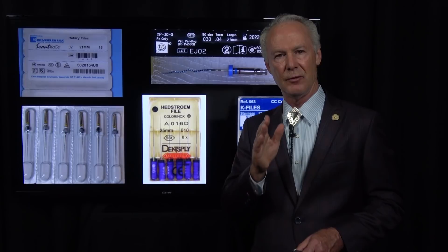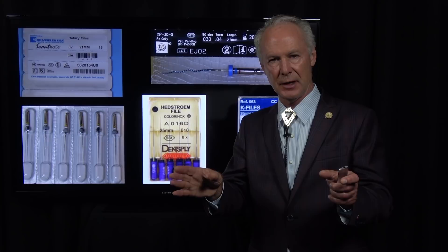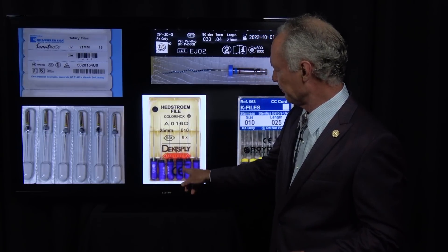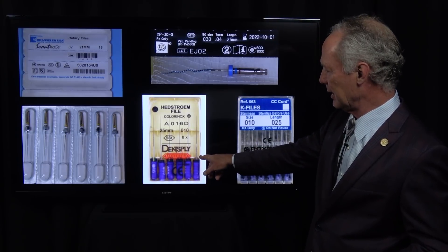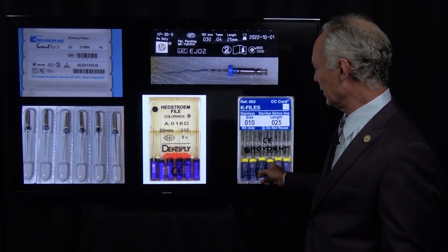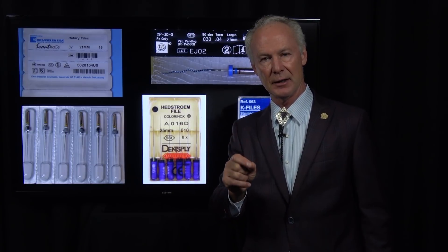Then come back with the Hedstrom or K files — I use a size 10, 25-millimeter — and clean out the nerve material from the canals. Irrigate with a 3-to-1 dilution of water to sodium hypochlorite: 3 parts water, 1 part sodium hypochlorite. Leave that in the pulp chamber and clean it out with the Hedstrom files. Then use your apex locator to confirm length — you want to be half a millimeter from the clinical apex.